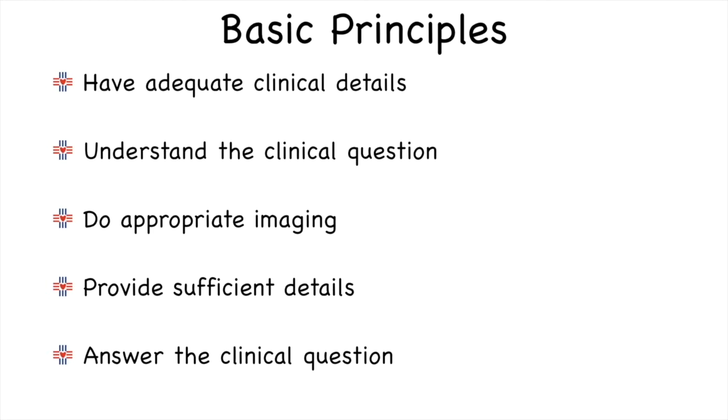user of these reports. So before you get into any cardiac MR reporting, it is very important that you have all the adequate clinical details and clearly understand the clinical question that is being asked to you.